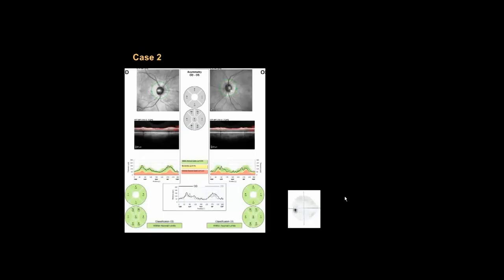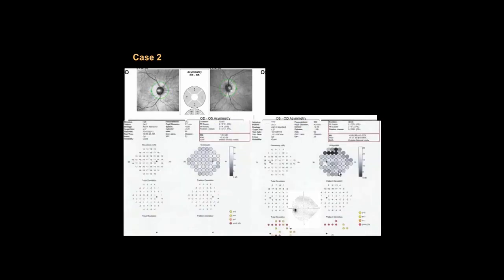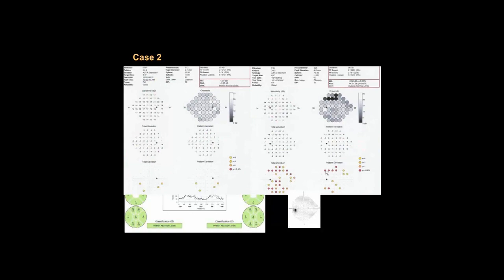Here is another case. The visual field is completely normal. The nerve fiber layer shows only slightly decreased thickness in the left eye, both overall within normal limits. But the surprise is in the macular thickness: the left eye, though it appears normal on RNFL, is significantly thinner than the right eye, with an arc-like loss in both hemispheres. We performed an FDF in this patient and found the right eye is normal, but the left eye has both superior and inferior abnormalities — with the superior abnormality greater, just as depicted on the macular thickness.